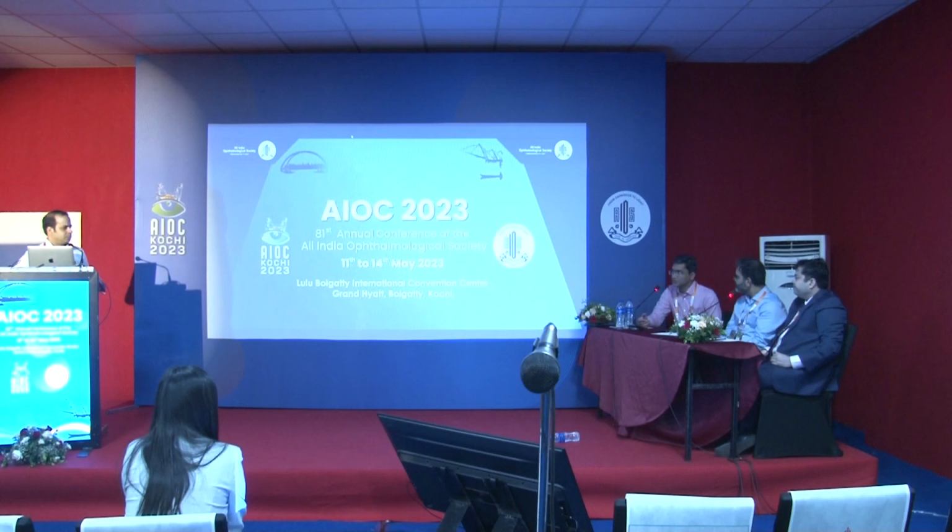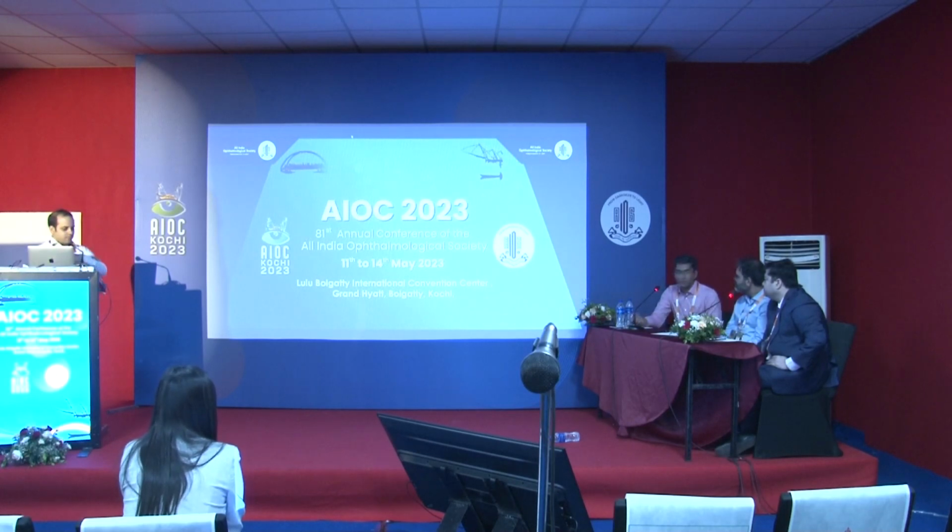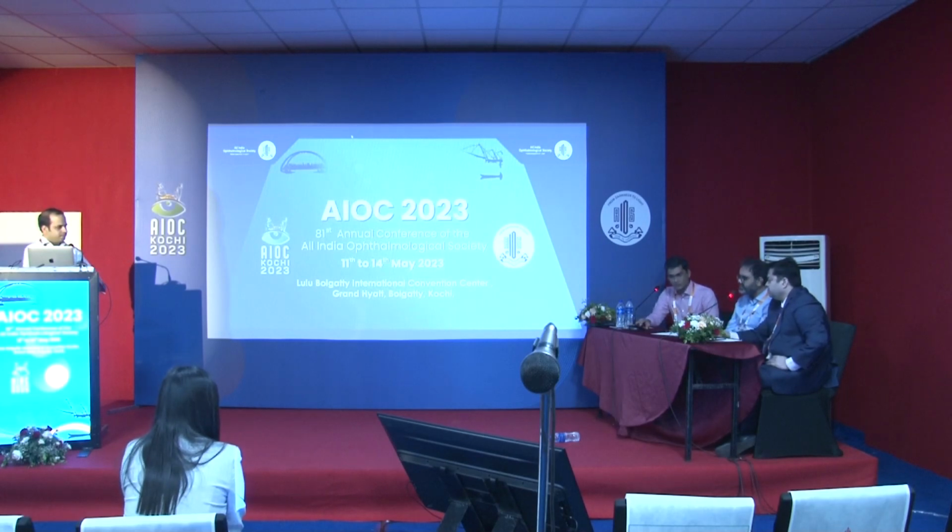Even if the cyst ruptures, the only thing mentioned in the previous literature is a significant vitritis post-op. But right now all the vitrectomy systems are so good that whatever the coagulum, once it gets dispersed, it's washed out easily. So that is not expected. Even if it ruptures, it doesn't have any issues. You don't tend to see the vitritis. That's true.